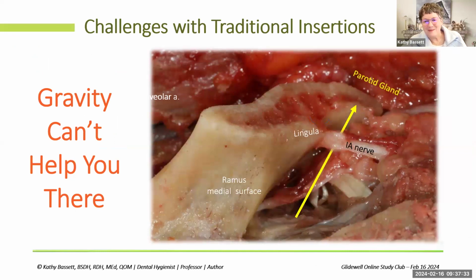So in this discussion, as noted, the challenge with an IA nerve block is that the needle may pass both below the foramen and the nerve. And then when we make contact with bone, we are both below and behind the nerve and foramen. And in the Curry and Townsend article, it suggests that 80% of depositions with a traditional approach end up putting the drug below and behind the foramen and nerve. And this is right here at that level of the circle.